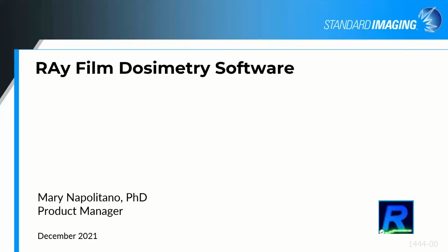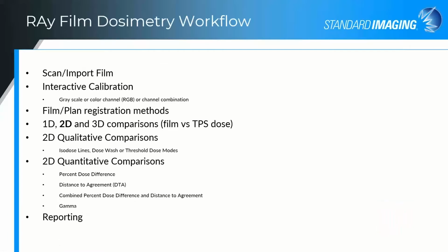Hi, I would like to talk to you a bit today about Ray film dosimetry software. So these bullet items are the steps I'll describe in further detail about Ray film dosimetry software.